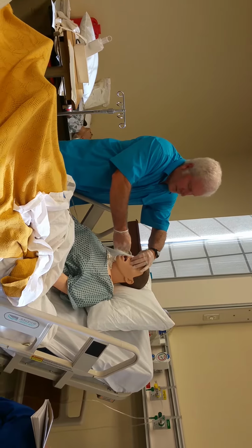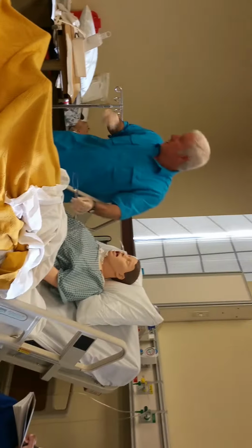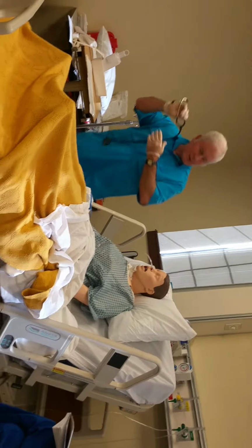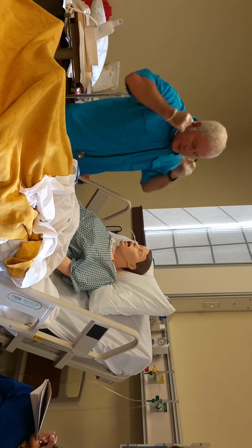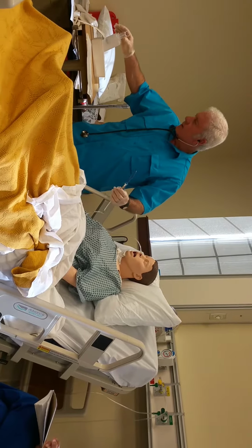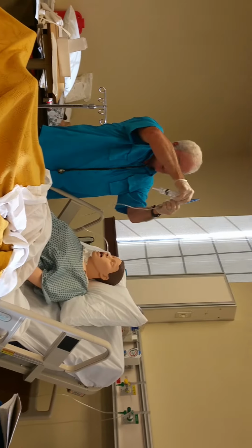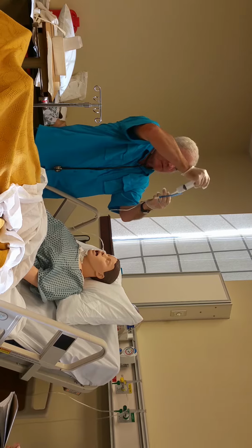Okay? So now the NG tube's in place, I've got it clamped, so I didn't really have to worry about it leaking. So now I'm gonna put my stethoscope on. I'm gonna say, you doing all right? He's doing good. So I'm gonna say, okay, what we're gonna do now is I'm gonna listen to verify that I have it placed correctly. I'm gonna get my stethoscope. Remember to hold it above him. If you don't, you're gonna have stuff everywhere.